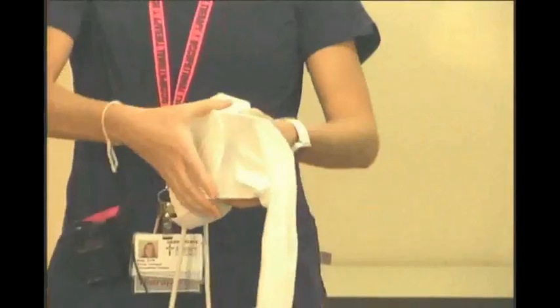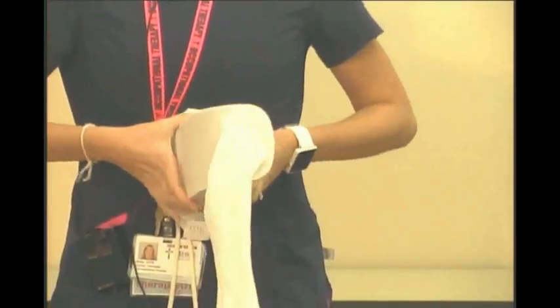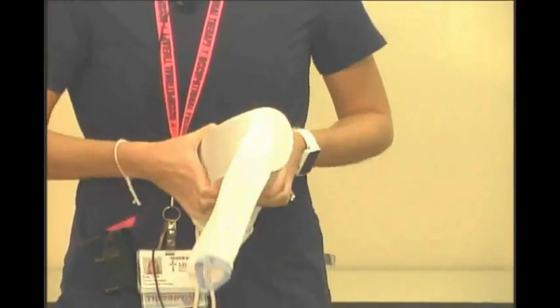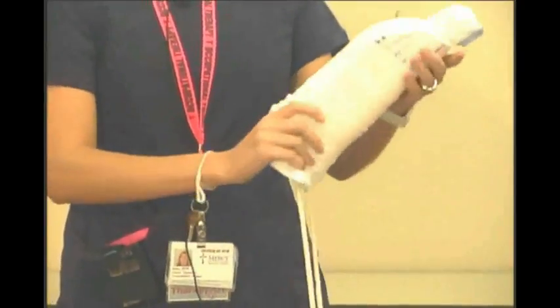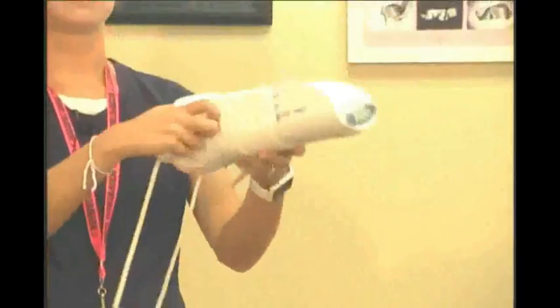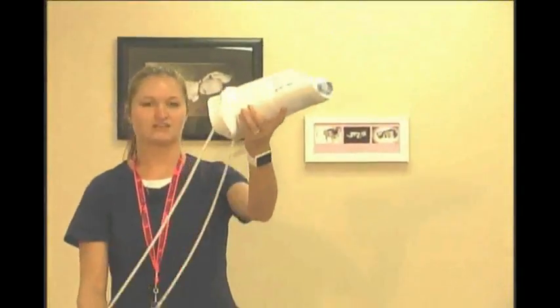I like to turn it on its side and then kind of squeeze the ends together. This allows me to have a little extra grip, because you'll need some grip strength in order to do this. So I get it all the way down so that the toes are at the very end. There's kind of a little pocket for the toes. You'll notice there'll be a nice opening right here for your foot. Then you're going to go fishing.